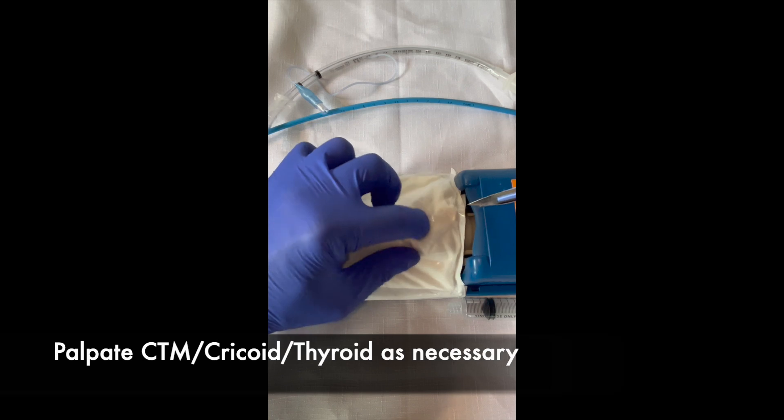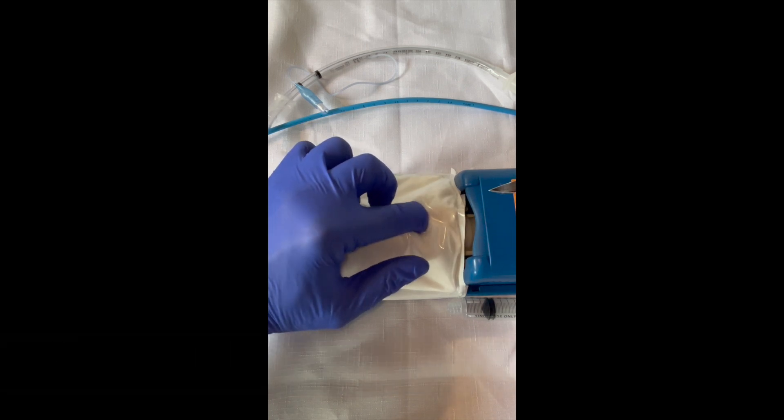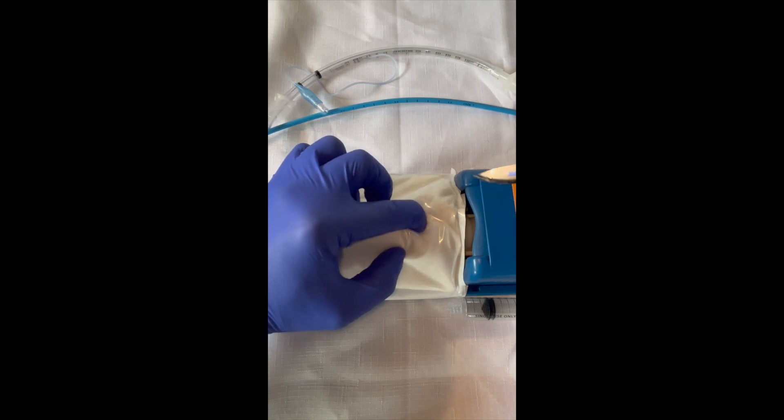Using the index finger to palpate the cricothyroid membrane and confirm its location. In this case it's very clear and I'm happy.